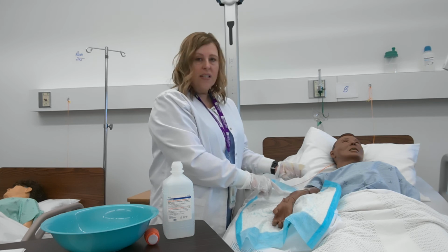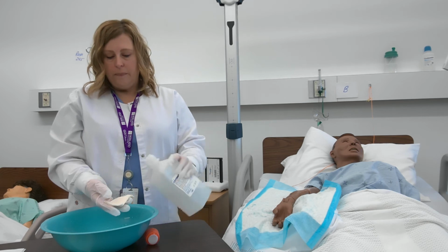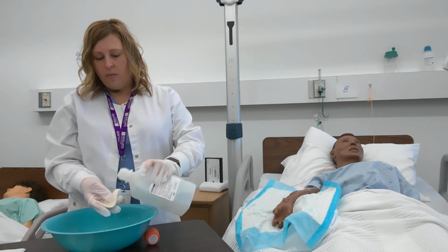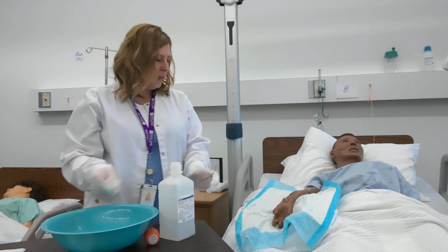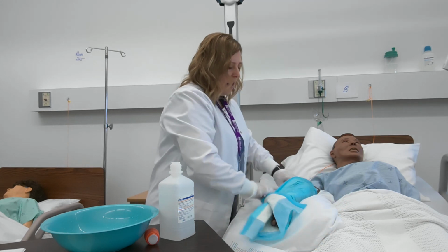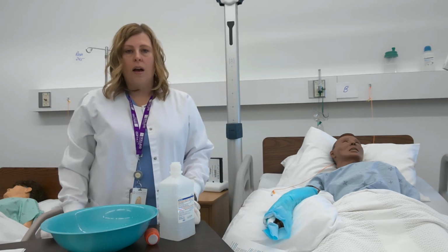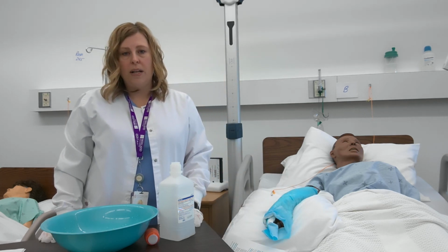If the pad feels like it's lost some of the heat, I'll go back and add some more fluid, rewarm my pad, place it back on my patient, and wrap it up again. I'm going to do this every 5 minutes until the completion of the treatment, so around 15 to 20 minutes.